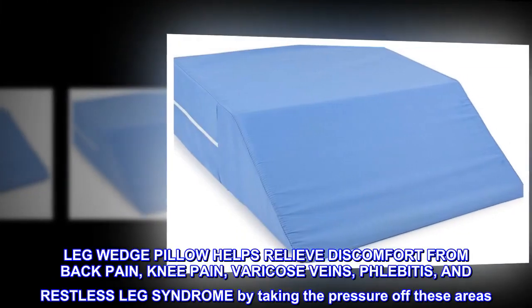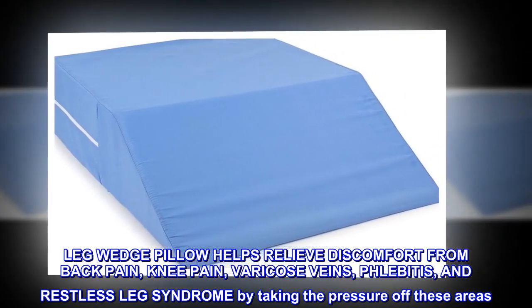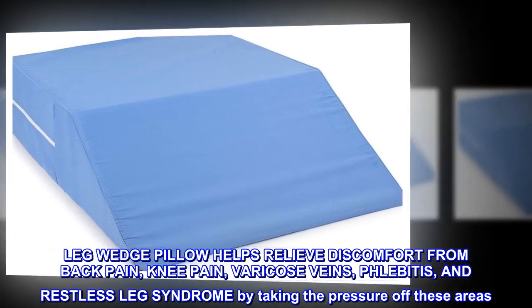The leg wedge pillow helps relieve discomfort from back pain, knee pain, varicose veins, phlebitis, and restless leg syndrome by taking the pressure off these areas.